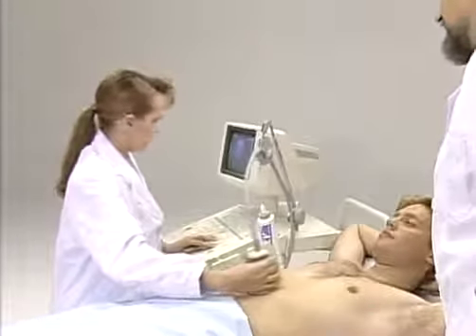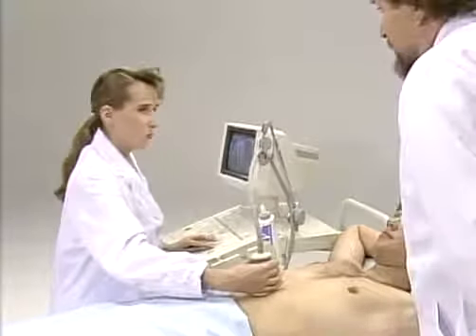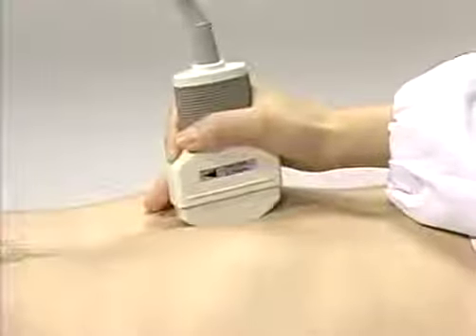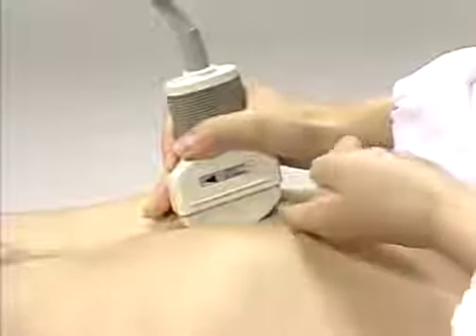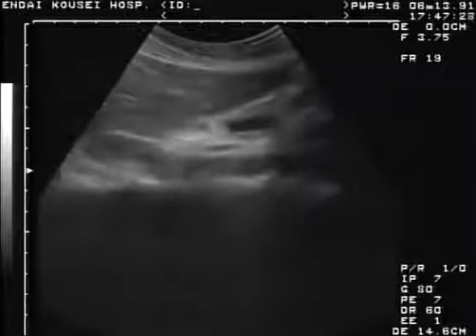Professor, if I can't find the direction during an examination, what should I do? Don't worry. Lift either side of the probe or place a finger under the probe tip, and the corresponding side of the image will disappear. Thus, you can recognize the direction.